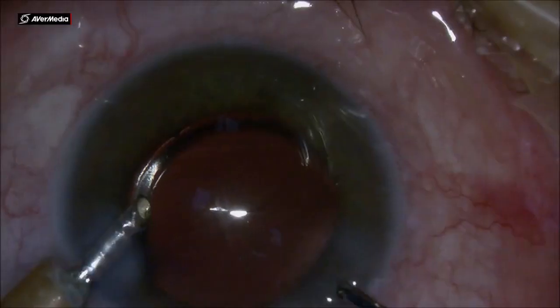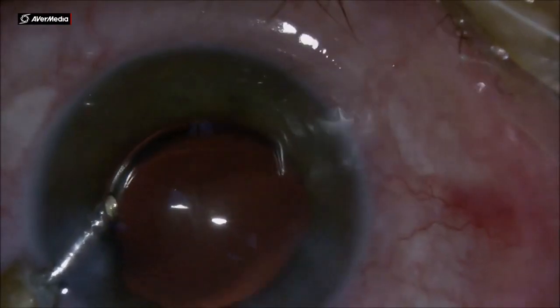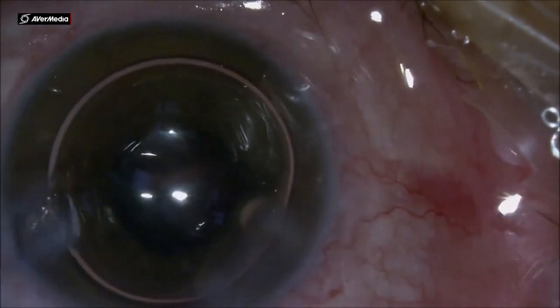Injecting the IOL under irrigation inside the bag is very easy to do. Cleaning up the anterior chamber of viscoelastic, injecting some intracameral agent to constrict the pupil, and an air bubble at the end. And that's the last part. Thank you for your attention.